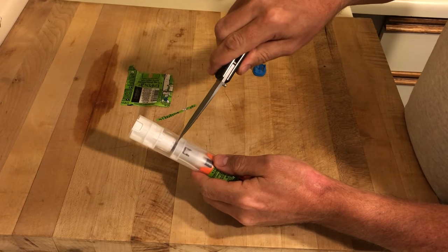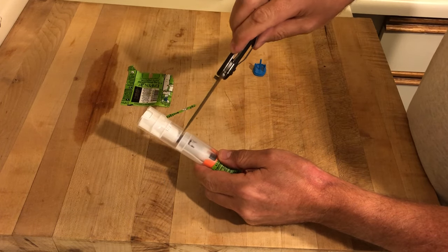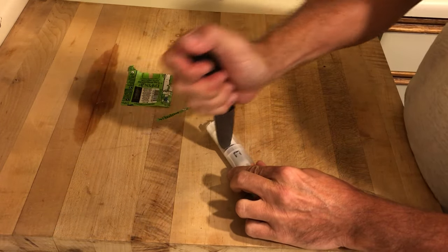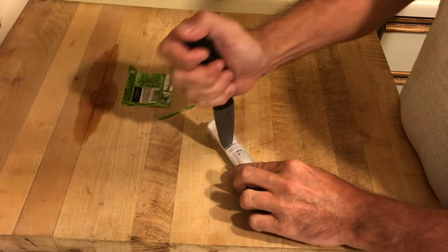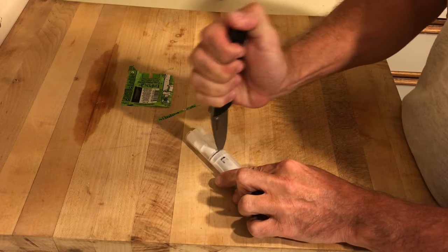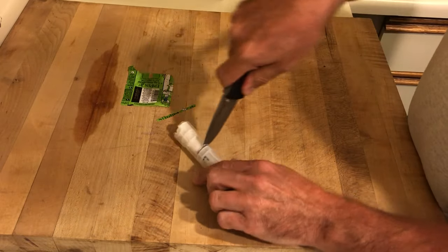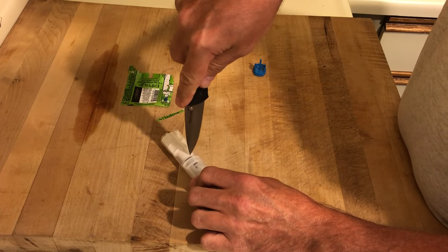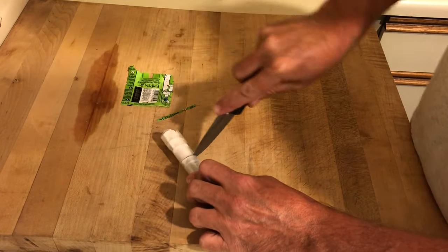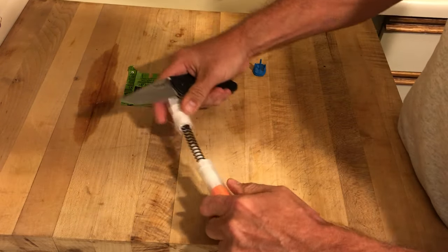Here you can see there's a natural separation between the two firing mechanisms of the pen. Gently and carefully, take your knife and cut right between these two sections. If you use a rocking motion it's probably easier to cut the plastic. Be careful not to let it shoot out because there's a spring in there that's going to take off when you open it up. Work your way around the EpiPen to the other side and cut through all the way around.